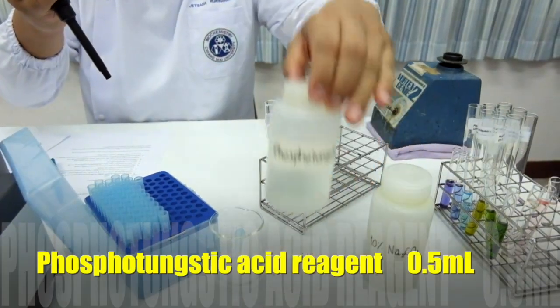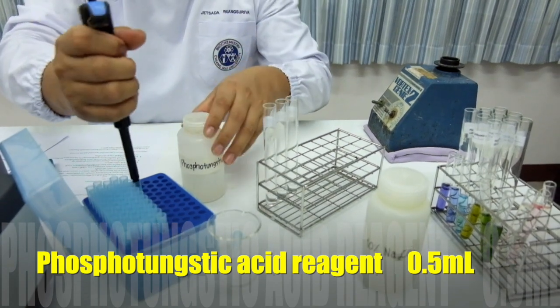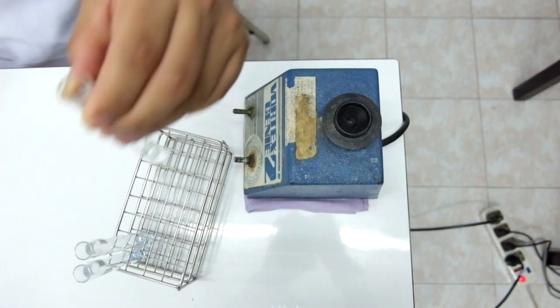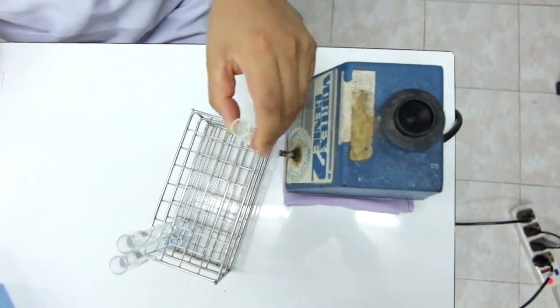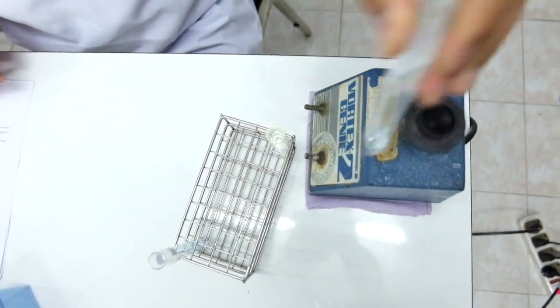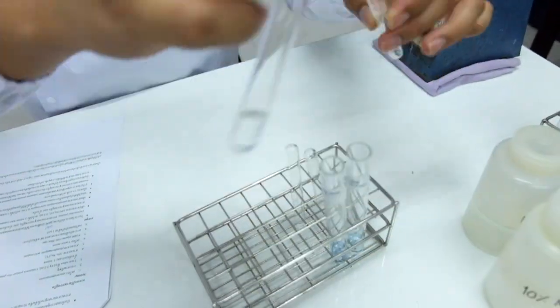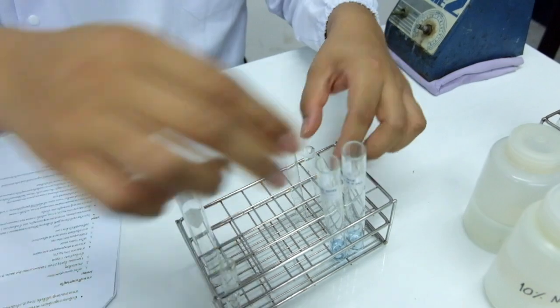Then add 0.5 milliliters of phosphotungstic acid reagent into all the tubes. Mix well with the vortex mixer and let them stand in room temperature for 15 minutes. After that, pour the solution into cuvettes.